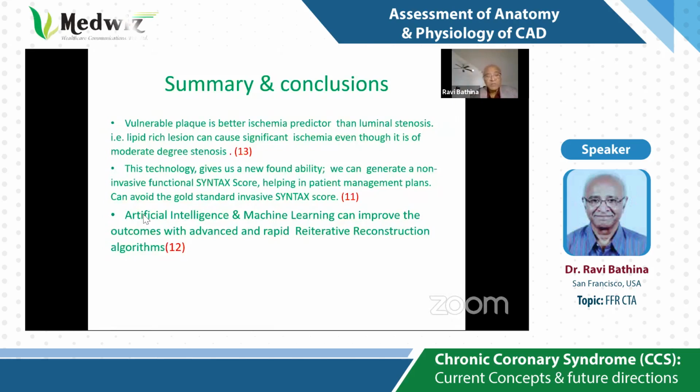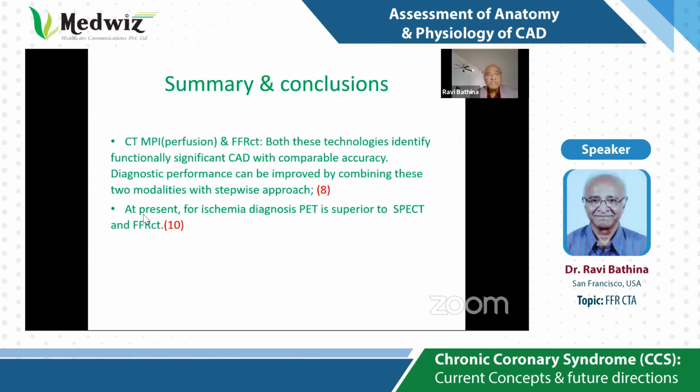And there's a quantum leap in recent years by adding artificial intelligence and machine learning in terms of reconstruction technologies. Now, this is a new kid on the block, CT perfusion. I think my next speaker, Dr. Johan Christopher, will speak on CT perfusion.